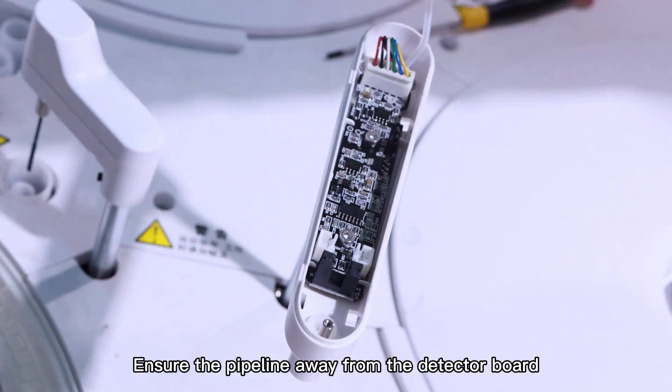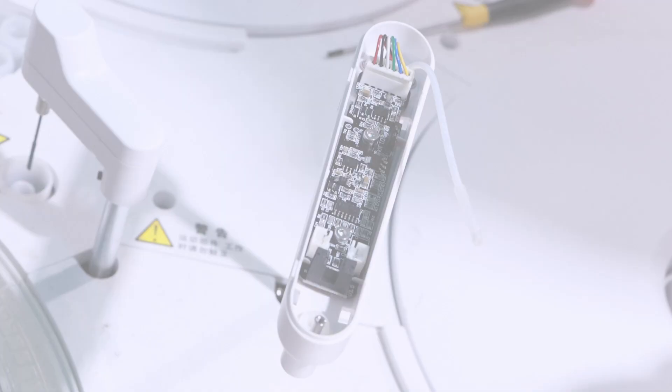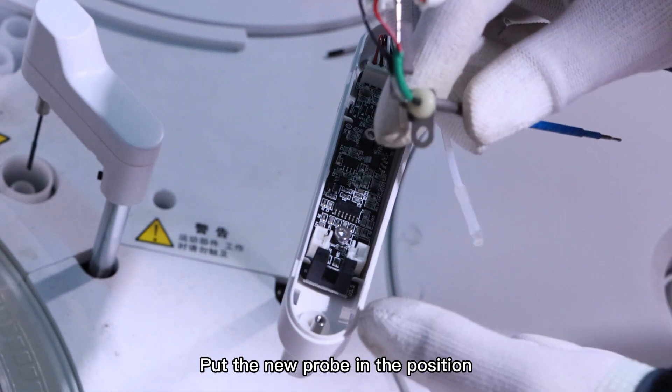Keep the pipeline away from the detector board. Put the new probe in position.